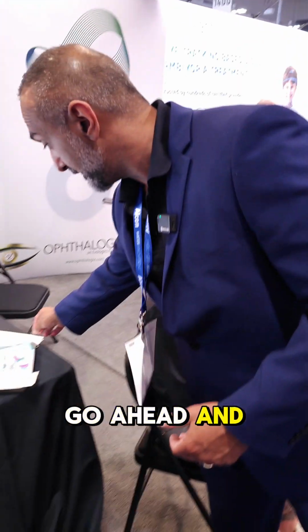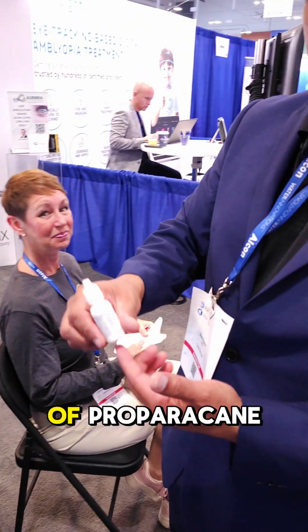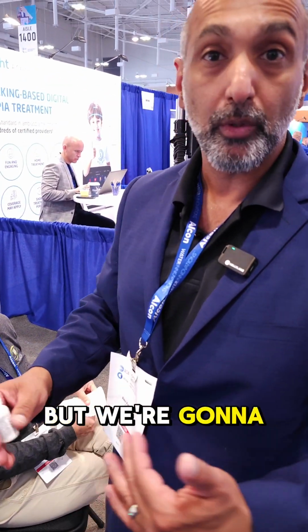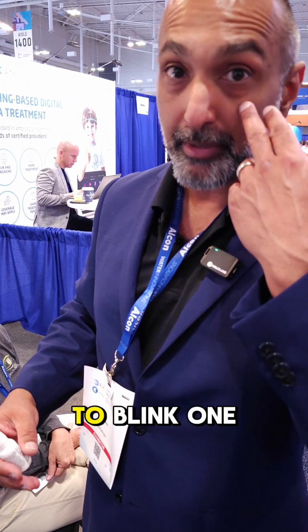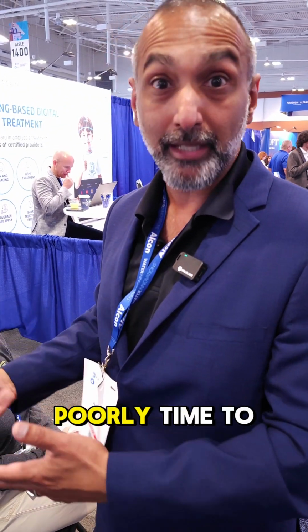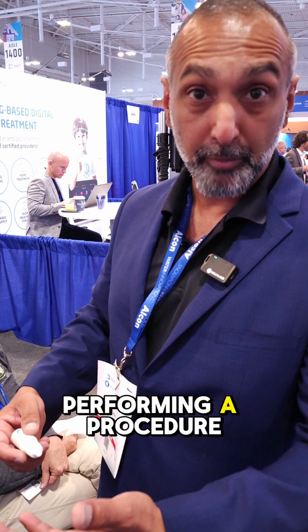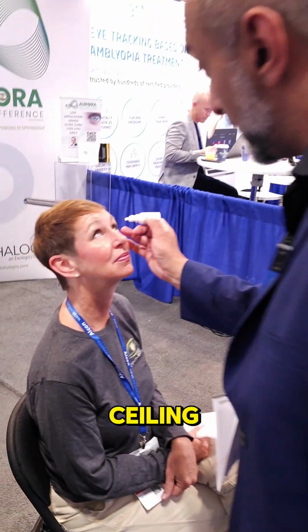So we're going to go ahead and give her tissue. We're going to give her one drop of proparacaine to each eye. We're treating one eye, but we're going to go ahead and put one drop in each eye. Why each eye? Because if she feels the need to blink one eye, well, the other eye is likely going to blink as well. And if that's a poorly timed blink for us performing a procedure, it could disrupt the procedure. So she'll look up to the ceiling.